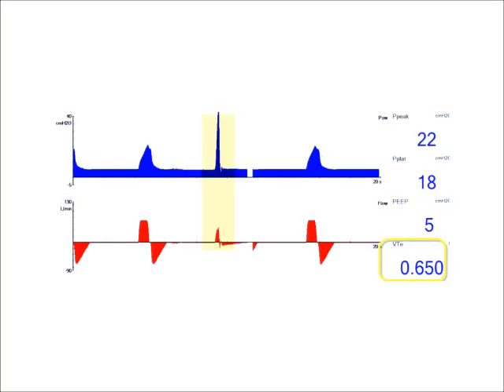This next example shows the patient trying to exhale sooner, or actually coughing — a premature termination of the breath. We see a normal inspiratory phase, and this highlighted breath is a lot skinnier. The patient is coughing during the inspiratory phase, hitting the high pressure threshold here at 40, and it is ending the breath prematurely. That is the only way the patient is allowed to exhale.